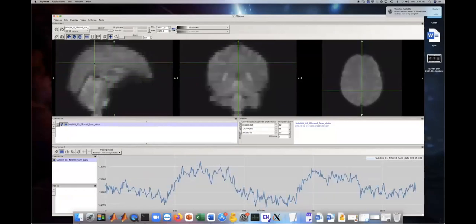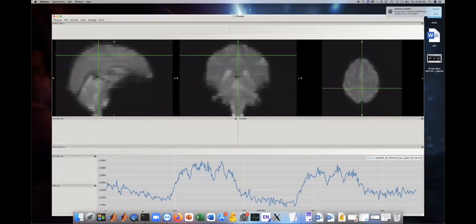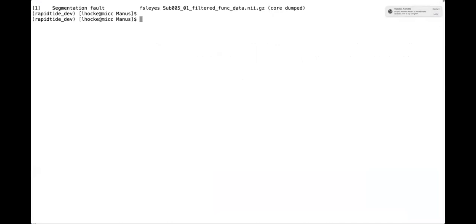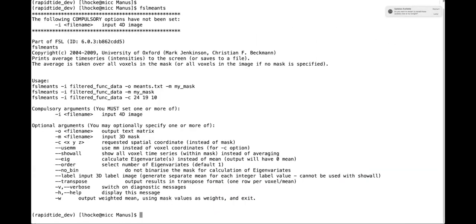You see, if we go through the data, this is a very pronounced signal throughout the brain, which would not have been taken into consideration if we had used the standard delay mapping parameters, which we used in rapidtide before, with just --delay mapping. We can choose an example voxel here, for example 39, 29, 23, and further examine it. So let's extract that voxel with fslmeants.